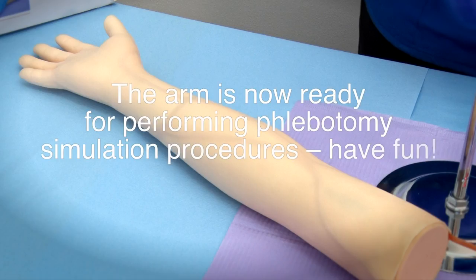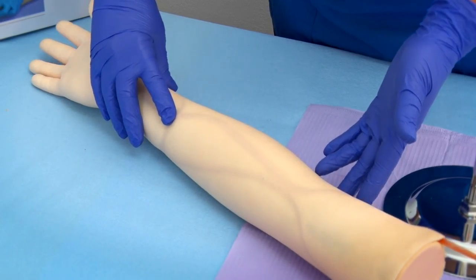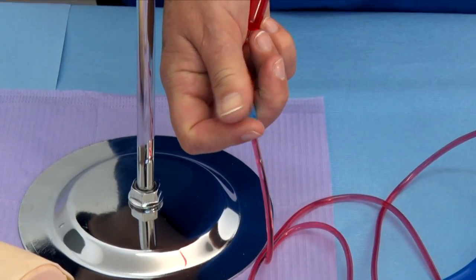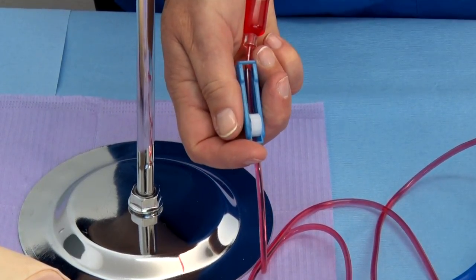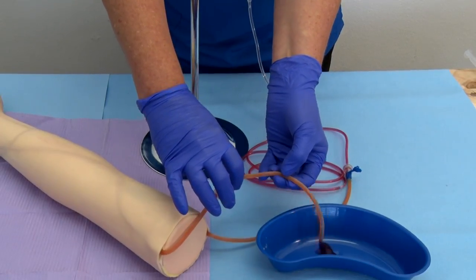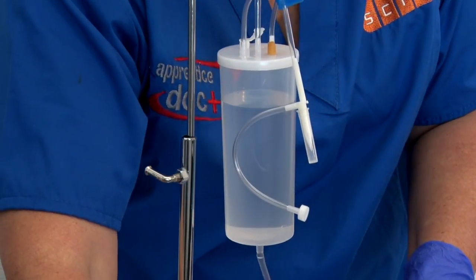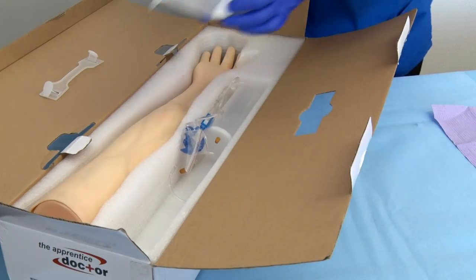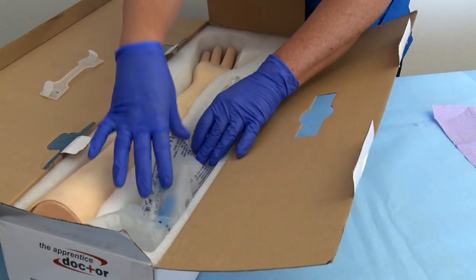Step 21: The arm is now ready for performing phlebotomy simulation procedures — have fun! Step 22: At the end of the training practice session, close the roller clamp and move to a basin. Step 23: Open all clamps and allow the fluid to drain into the basin. Step 24: Flush the container and tubes with water and allow to drain and dry. Step 25: Replace the arm and all items into the box.